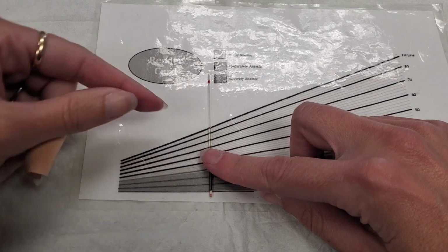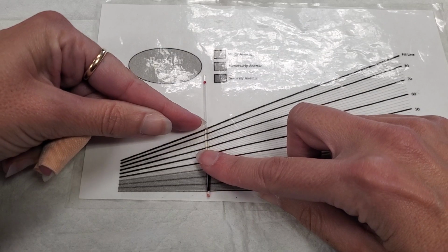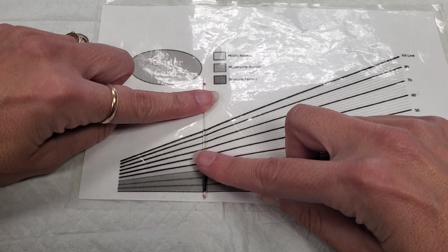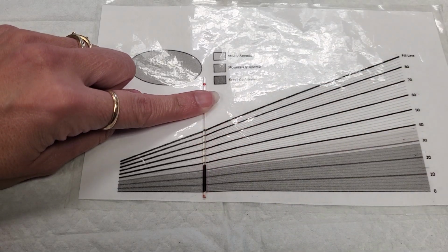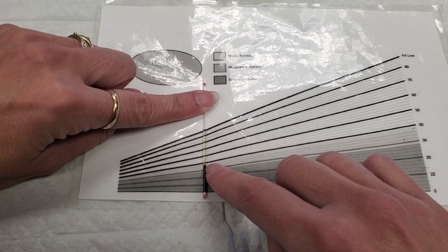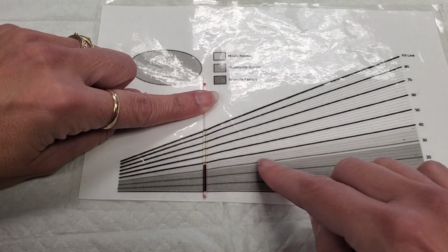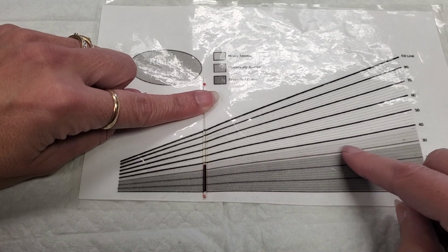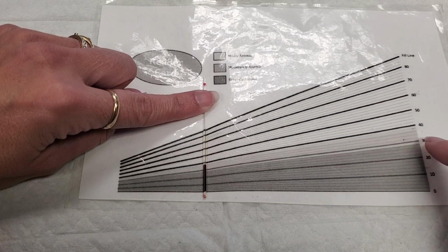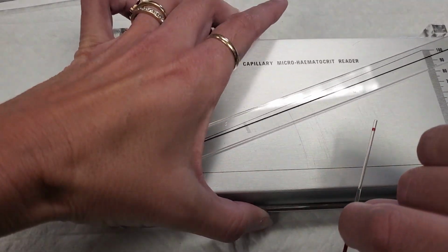Then you're going to roll the hematocrit capillary tube up until you get to match the very top line with the top of the plasma as shown. So now I'm holding it in place where those lines match up. And now what I do is I take a look at where my red blood cell transition to plasma, and I follow that line out to the numbers on the far right side, and I find out that I'm between 30 and 40% or about 38%.